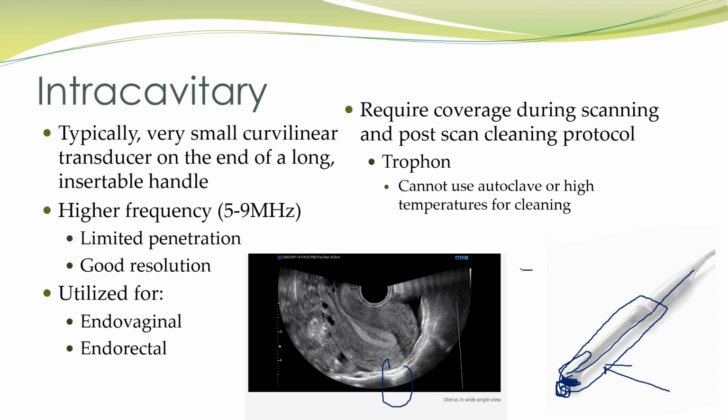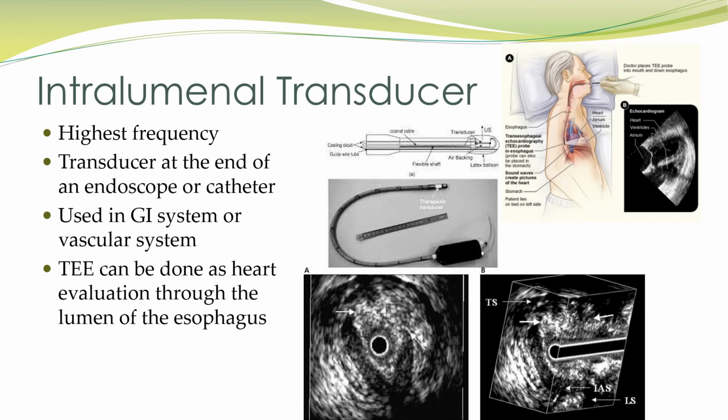When it's time to clean these, you slide the whole thing off, make sure all of the gel is removed. And the most popular approach to cleaning these currently is called the Trophon. It uses approaches without heat to kill any pathogens, which is going to be essential because, remember, the sterilization techniques we would commonly be tempted to use would actually take the piezoelectric qualities from our transducers, so those high heat temperatures are not an option for cleaning. So things like the Trophon or formerly Cidex work really well to clean these intracavitary devices.